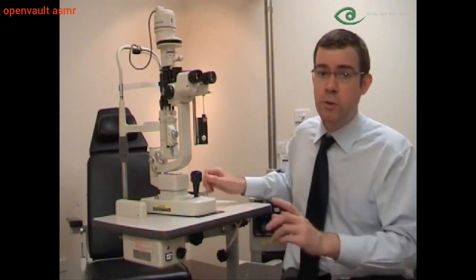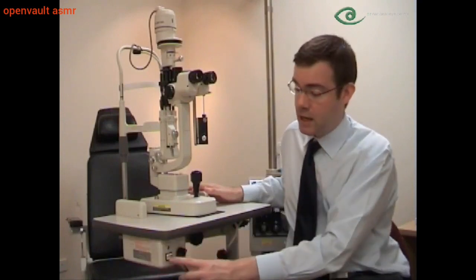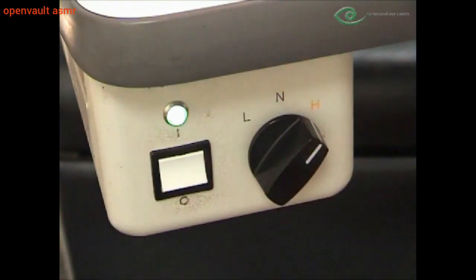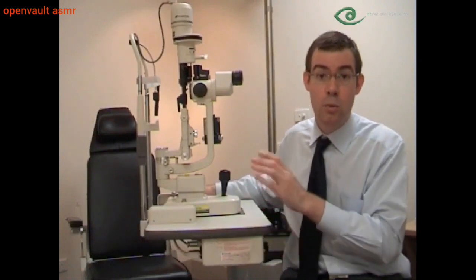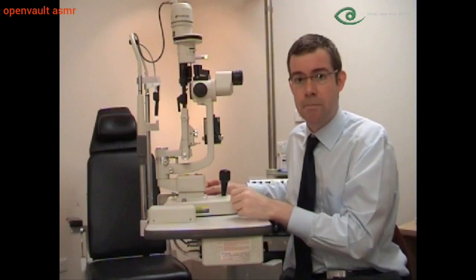The slit lamp has various controls, and it's important to know what each one does in order to use the slit lamp correctly. The first control is the on switch, which is located here on the power supply, usually under the table on the bottom left. Next to the power switch is a dial which adjusts the voltage, and this affects the intensity or brightness of the light. The slit lamp itself is divided into 2 parts, a microscope and an illumination system.